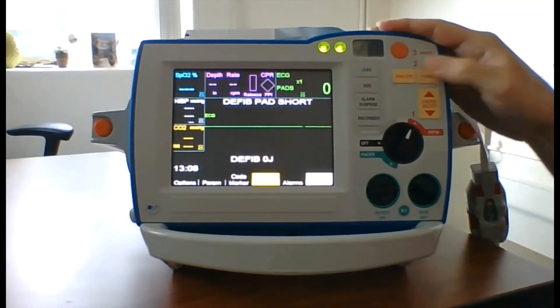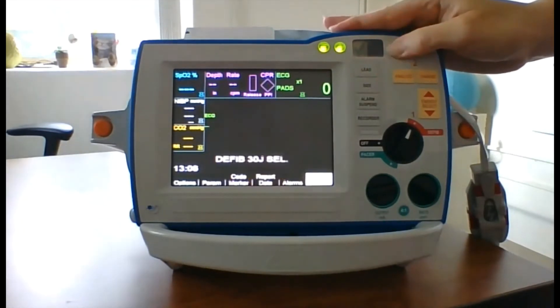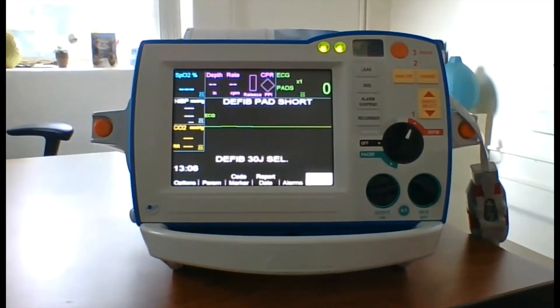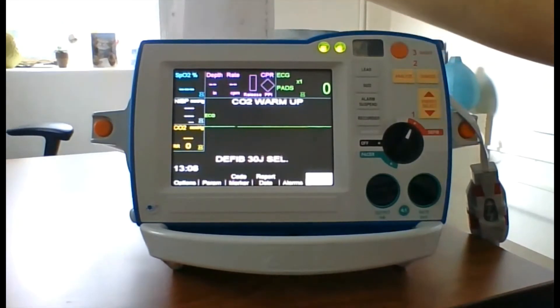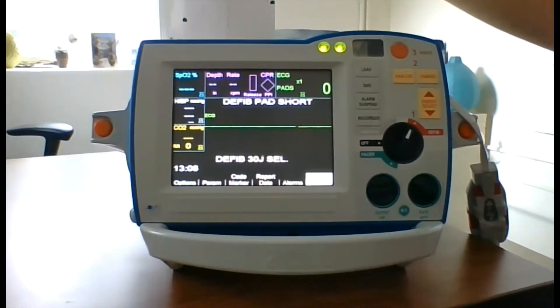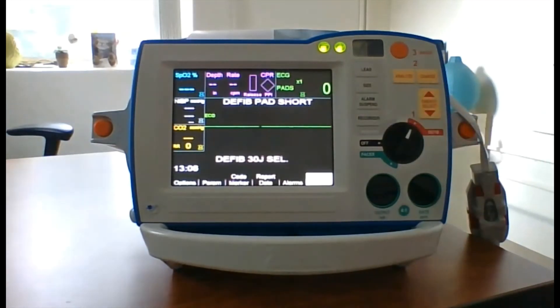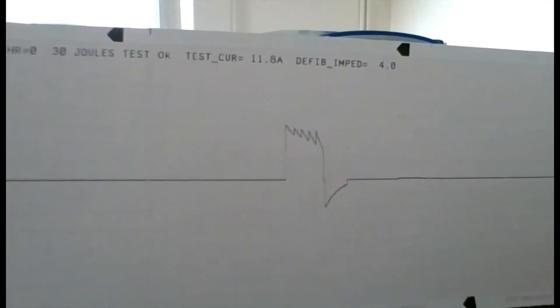Press the charge button. Press then hold the illuminated shock button. You'll see the 30 joules shock test OK with confirmation beeps and recording. Confirm the biphasic wave on the printout. You can hit the recorder button to stop, or it will stop automatically. Here's an example of the printout you will see to confirm the 30-20-30 test.